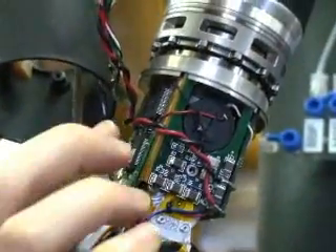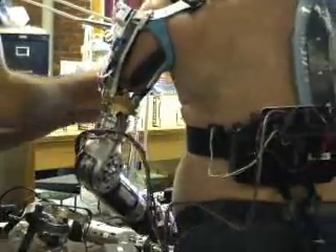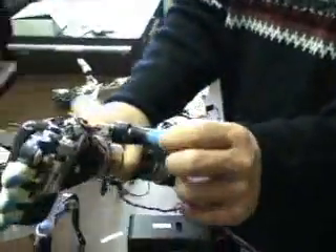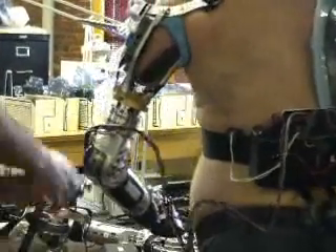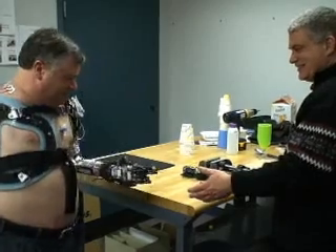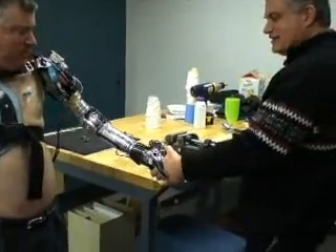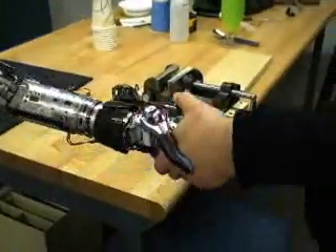There are actually 12 microprocessors in the arm. These sophisticated electronics also allow sensory feedback. There's a small sensor in the thumb that sends a signal to one of the microprocessors, which then goes to a small vibrating motor. The harder they grip, the higher the frequency of the vibration becomes — so it gives the user direct feedback on their grip strength.